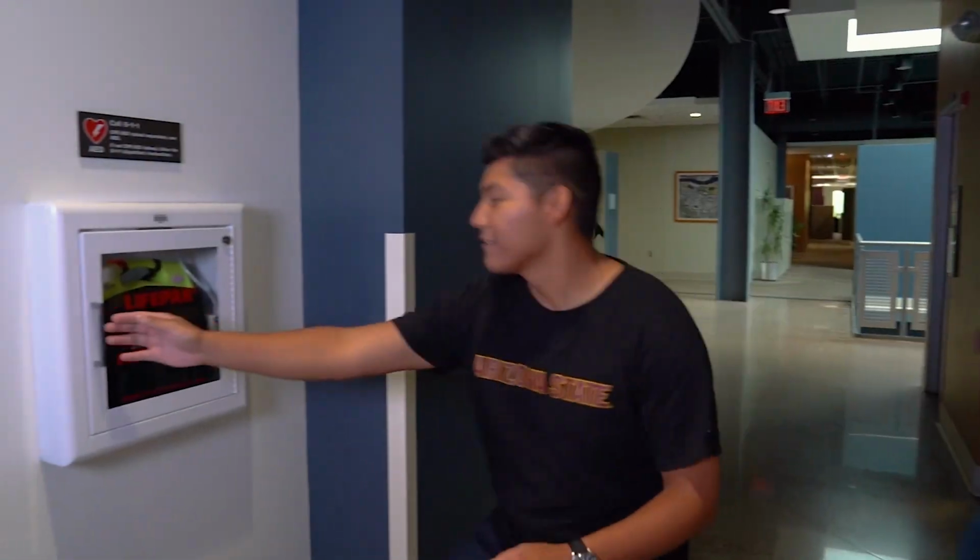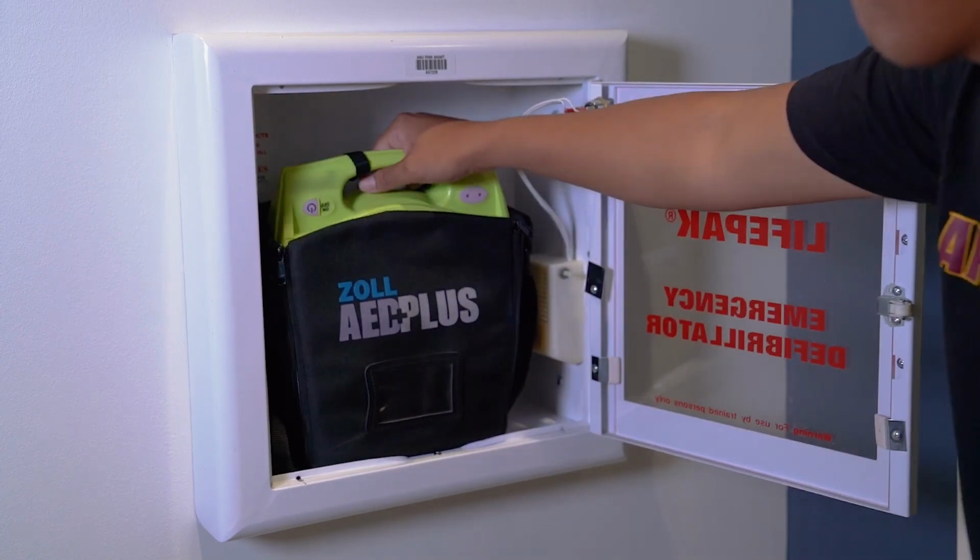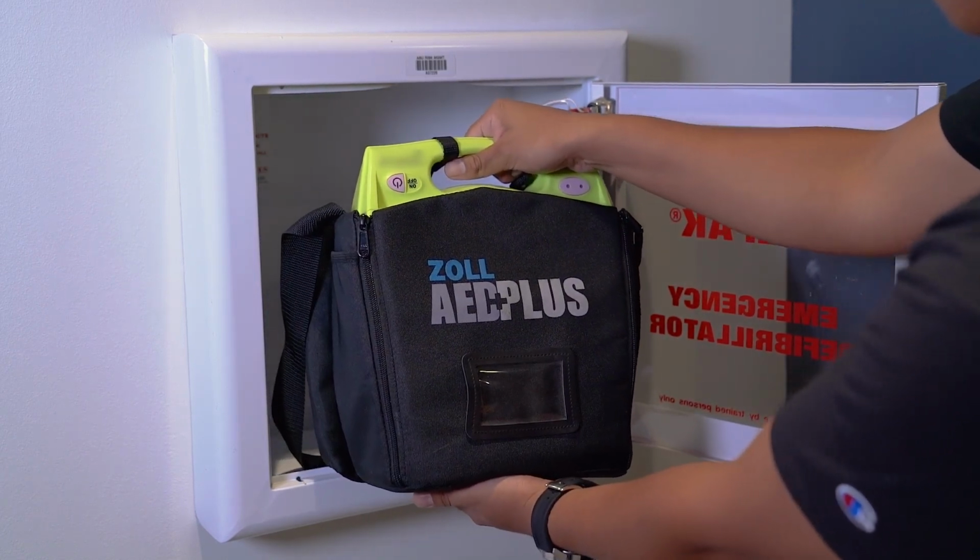Retrieve an automated external defibrillator, or AED, as soon as possible. Assess the victim's breathing and pulse for a minimum of 5 seconds, but no more than 10 seconds. It is important not to delay cardiopulmonary resuscitation, or CPR.